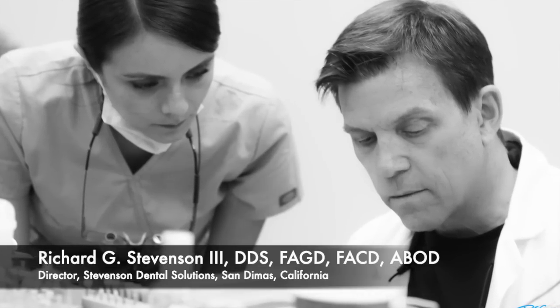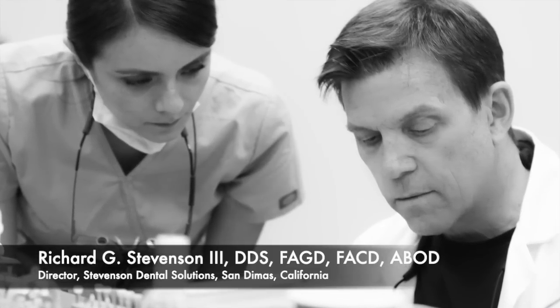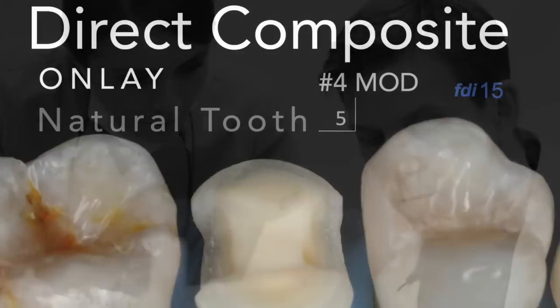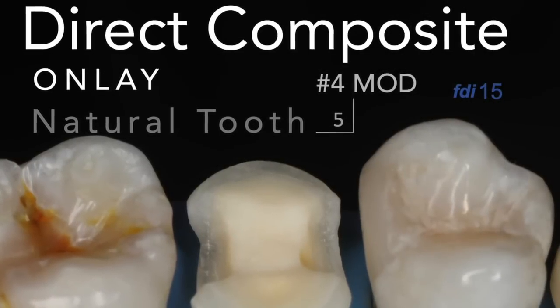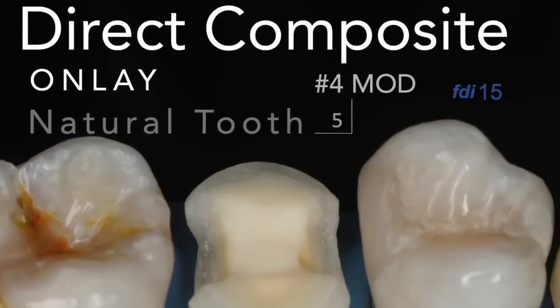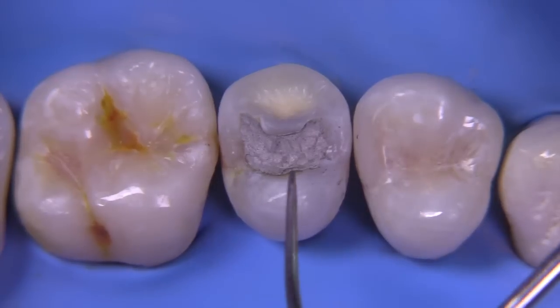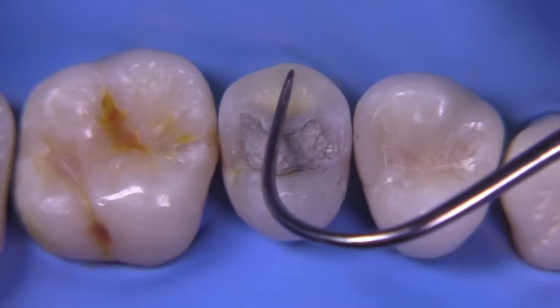Today we are going to tackle a project that might apply to patients who cannot afford an indirect restoration like an onlay. This is going to be a direct composite onlay, a procedure that you can perform in just one visit without the high expense of a laboratory or milling machine. It's nice to be able to offer patients lower cost options, at least to get them through to a point where maybe they can afford a more permanent solution.